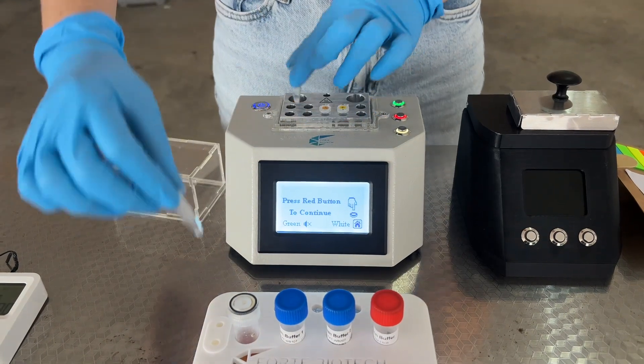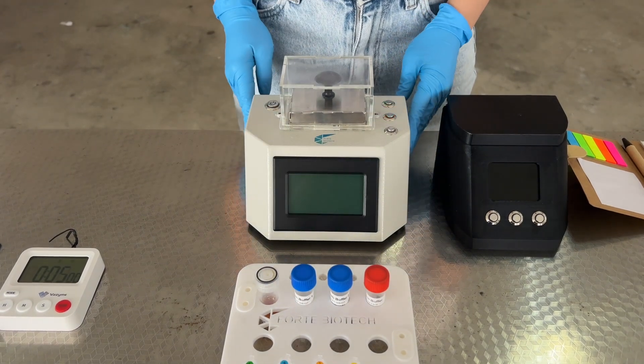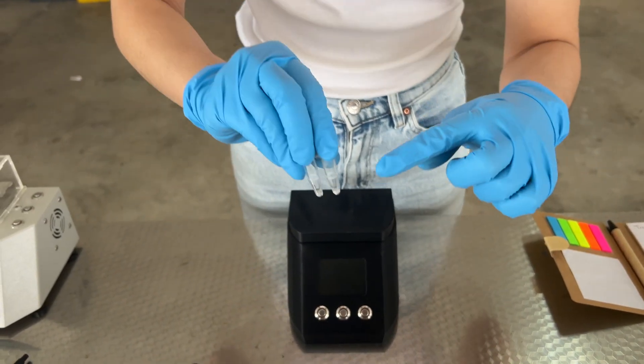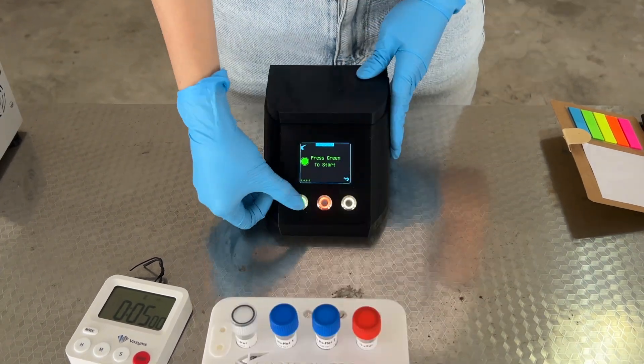After 40 minutes, transfer the tubes out of the heater and turn off the machine. Let the tubes cool for 5 minutes. After the 5 minutes, flick the tubes to bring the liquid to the bottom of the tube. Turn on the rapid reader and press the green button to start.